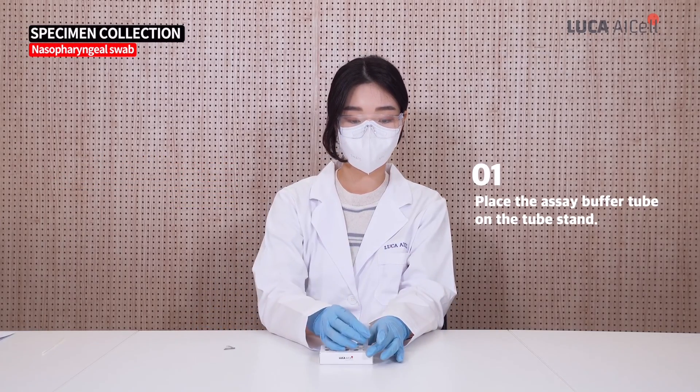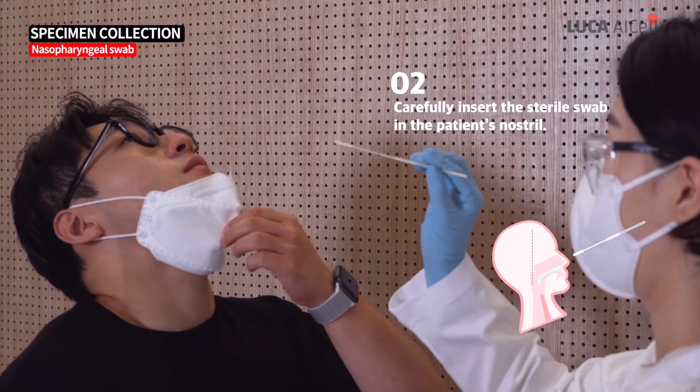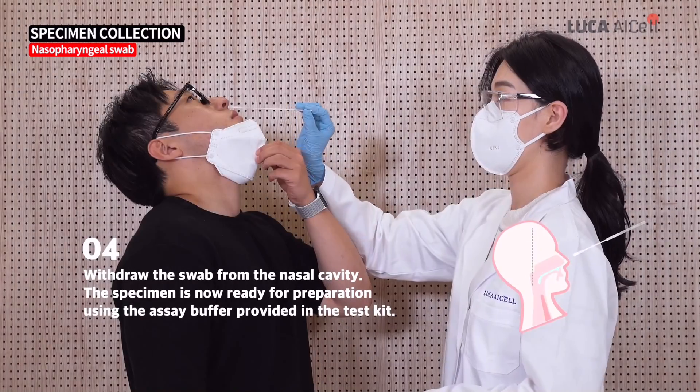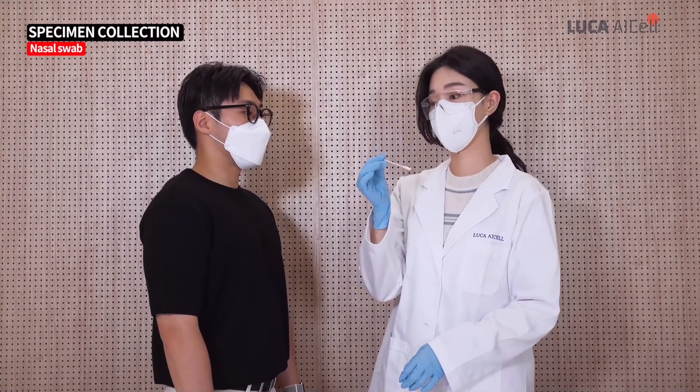The first method is using a nasopharyngeal swab. The second method is using a nasal swab.